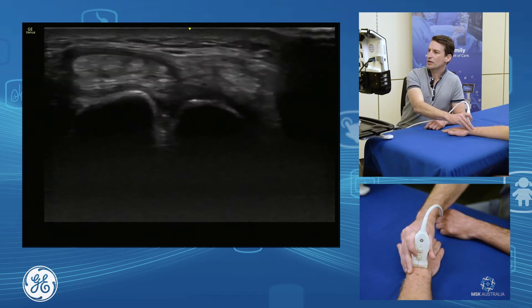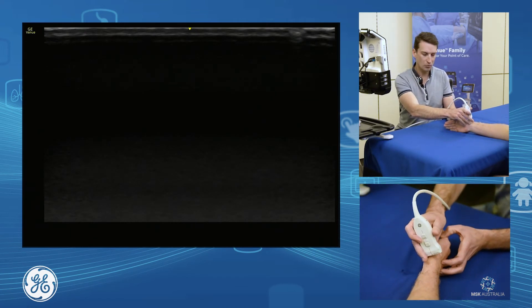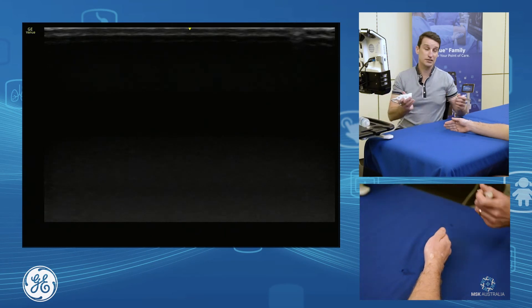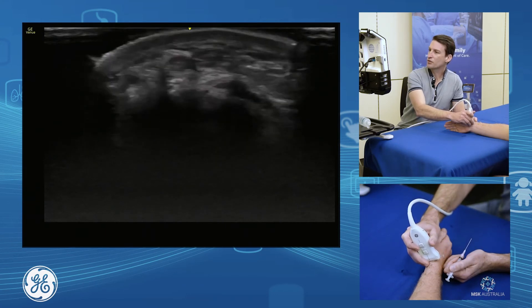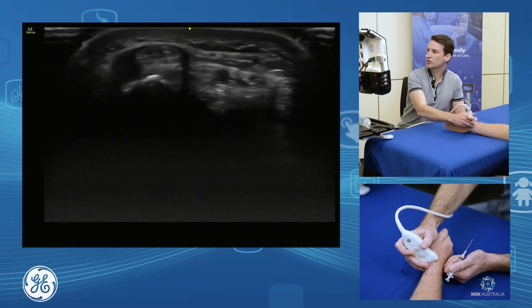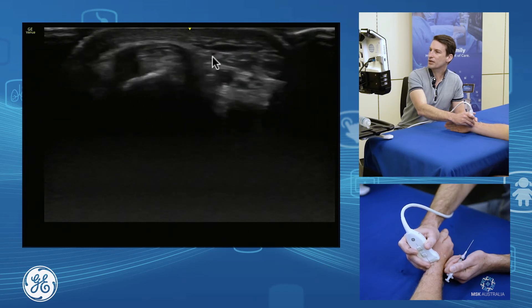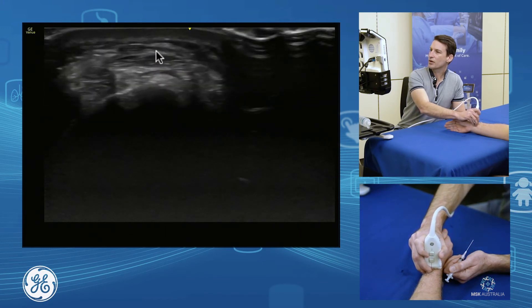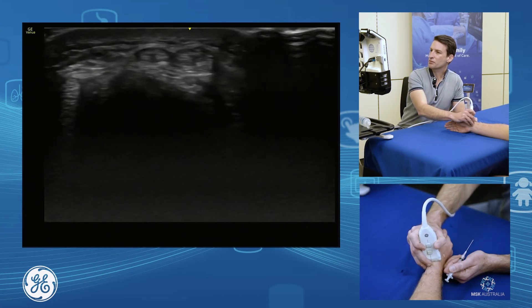Now, some injection technique. Let's start with de Quervain's and our compartment one tendons. Sitting next to our compartment one tendons is our radial artery and our superficial radial nerve — two structures we want to be aware of when injecting. On the volar side, we can see our artery and a little nerve sitting just above that, with our tendons sitting up over the bone. We've also got a little bit of nerve rolling over the tendons — these are the structures we want to be aware of.